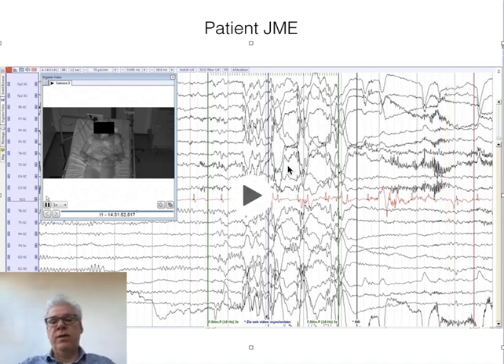So this is a particular kind of reflex epilepsy where you can induce epileptiform discharges by exposure to stroboscopic light, and the patient will experience jerks. Now, if you would look at a longer recording of this EEG, you may also find some interictal discharges that are not induced by the photic stimulation. So they are really interictal discharges. And all these observations help to make the diagnosis of epilepsy more or less likely. Now, this is definitely epilepsy, and in fact, this is a patient with a juvenile myoclonic epilepsy.